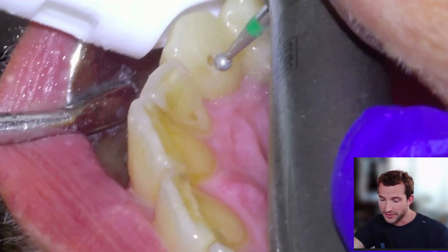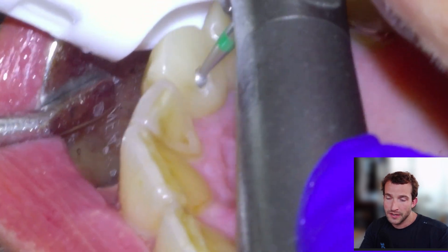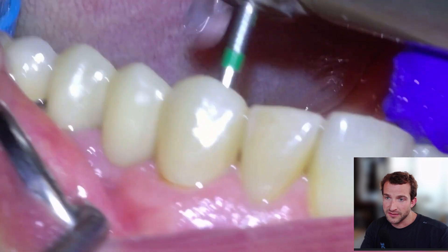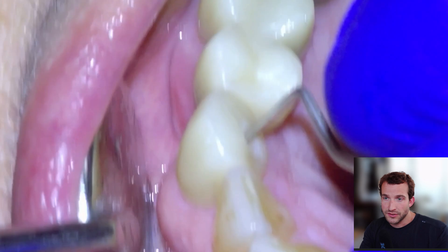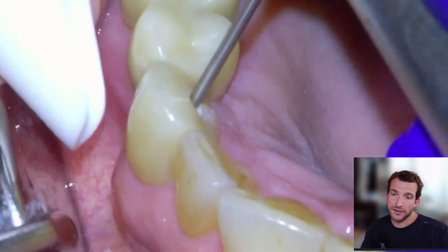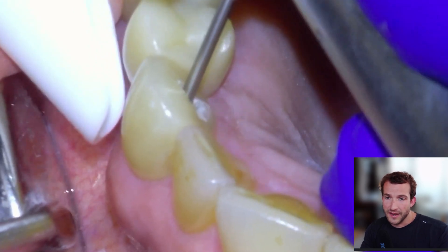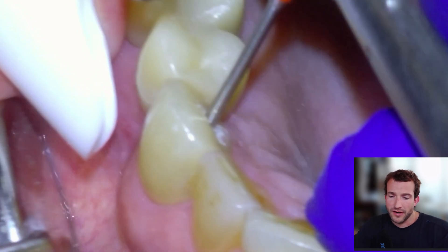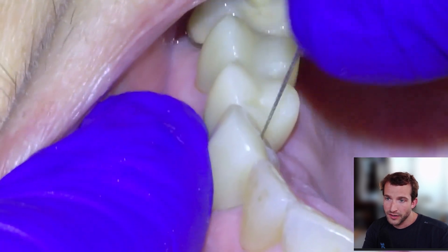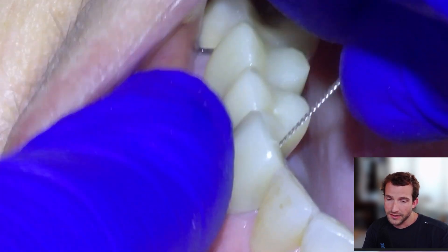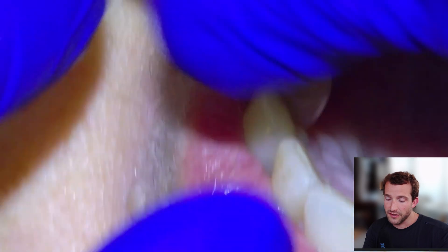Into the clinical footage — to resolve the symptoms, we're going to make an access into the lingual aspect of the tooth to do our endo, trying to make it as small as possible through the zirconia. We had relatively thick zirconia here, so we're not super worried that the fixture is going to fracture, but we are going to warn the patient that we don't love doing endo through zirconia. Once we have our high speed access, we'll go in with a Munce Discovery bur and prep down until we can see the pulp chamber, then try to get a file down into the canal. Once we can feel the file drop into the canal, we'll get a rubber dam on and complete the endo as usual.